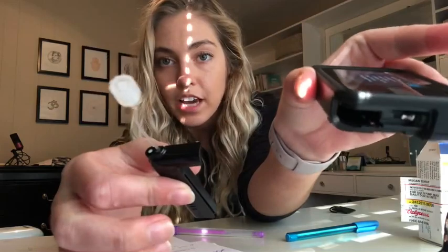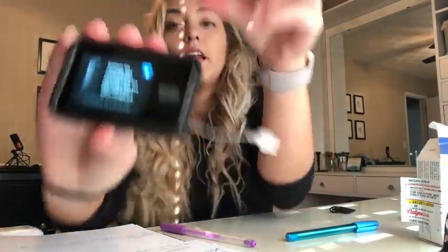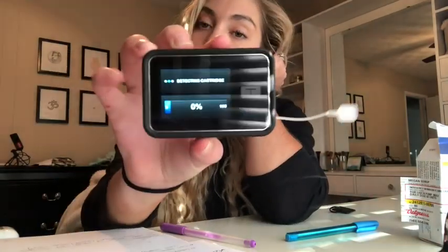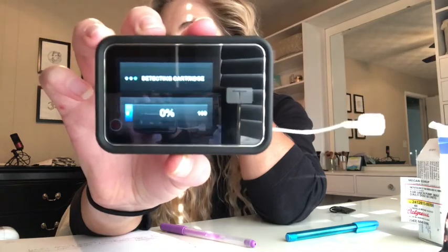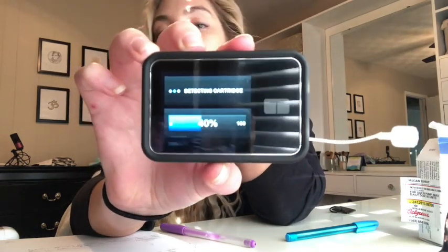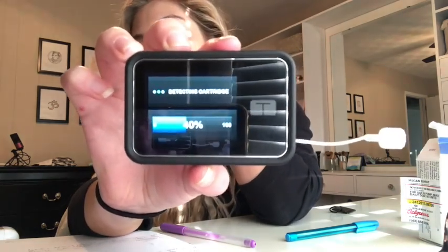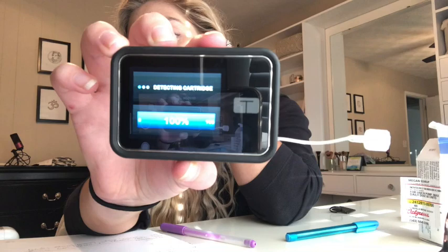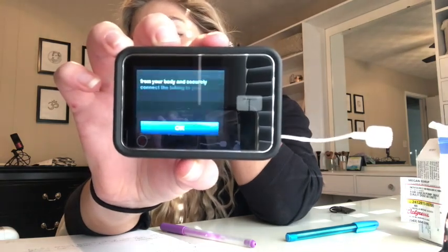So I take my insulin cartridge and you can see there's a big gap where you slide it in and then just kind of push it down into place. And then I'm gonna go ahead and hit this blue little unlock to say the cartridge is in. Is the cartridge installed? Yes. And then it goes through this little thing where it detects the insulin in the cartridge to make sure it's installed correctly. Okay, so 100%, so that was good.